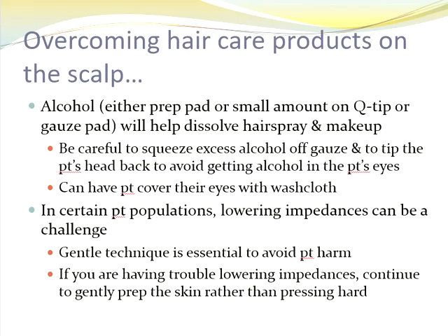Hair care products. All the patients are given instructions to come with their hair clean and dry, free of hair care products, their face free of cosmetics and lotions. Fairly rarely do patients actually read that. Same thing for you guys, though. Try not to come with any hair care products or anything like that, because it really can make the job a little more difficult.